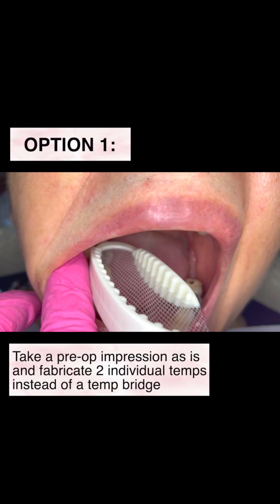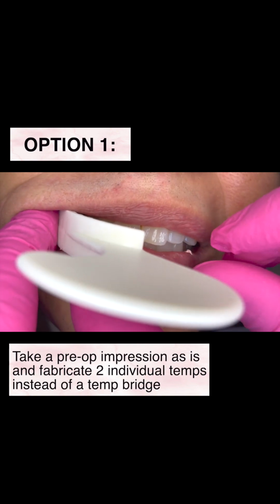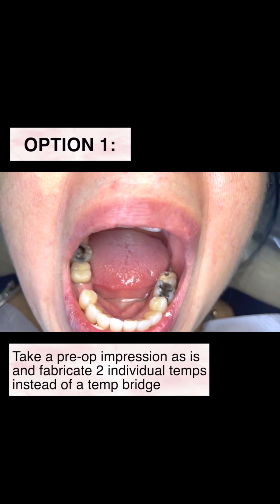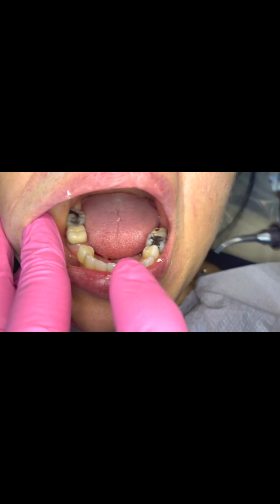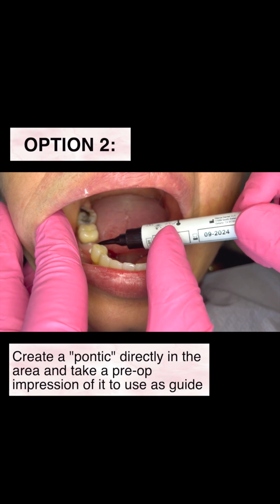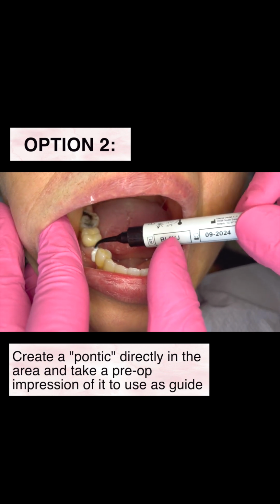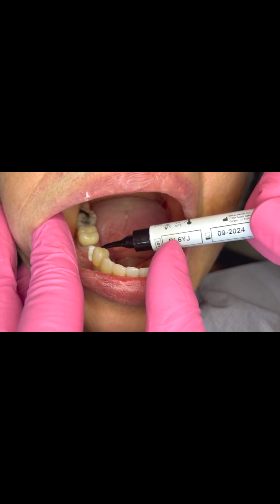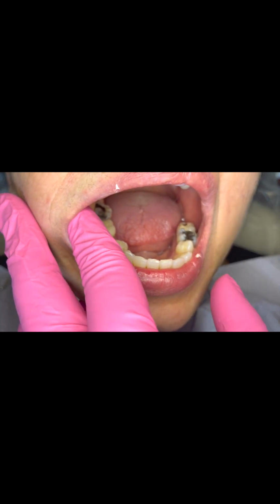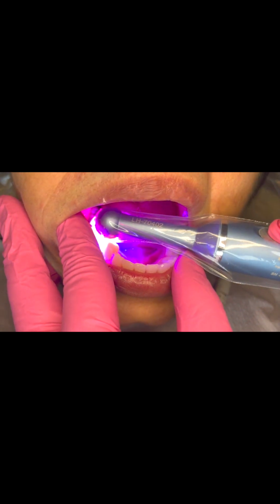First option is to take like a triple tray impression so that you can fabricate individual temporary crowns instead of a temporary bridge. Another option is to use something like liquid dam, and we usually have leftover liquid dam from the Zoom whitening treatments. So this is perfect to basically create the fake tooth in the pontic area like you see in the video. And you want to do this in layers.